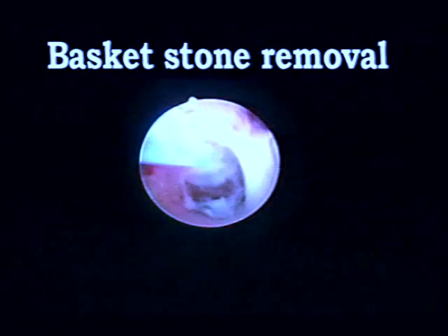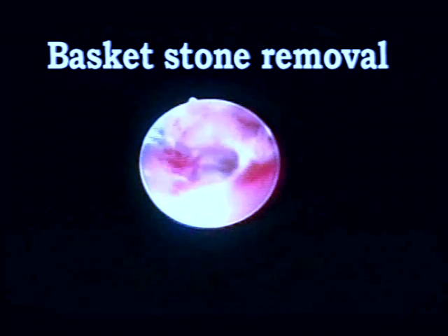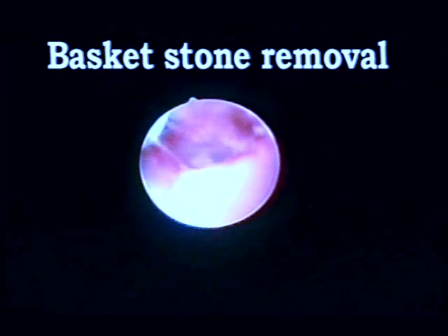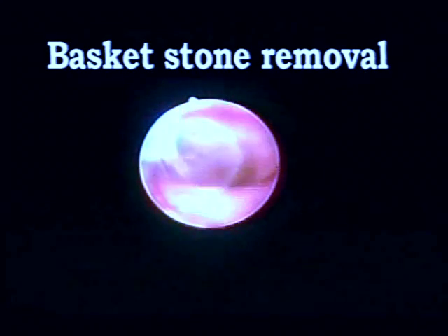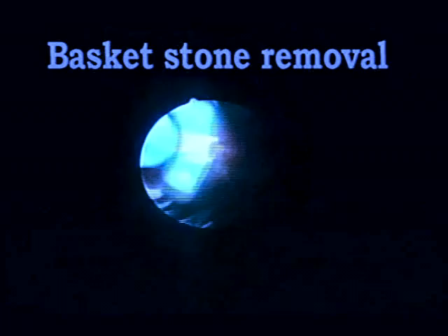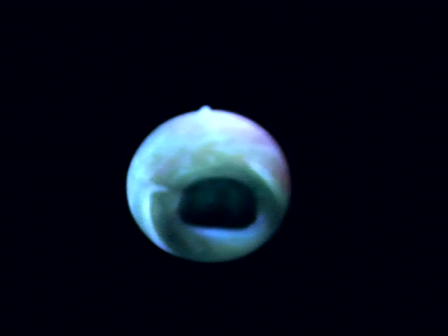Basket stone removal may be the most commonly used method for cholangioscopic stone removal. For this technique, a basket should be introduced into the bile duct through the instrument channel of the cholangioscope. An optimal location of the basket before opening may be just behind the stone, and open the basket at the posterior side of the stone. A gentle pulling movement can engage the stone inside of the basket.